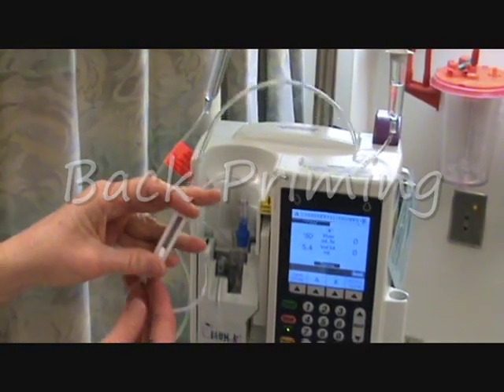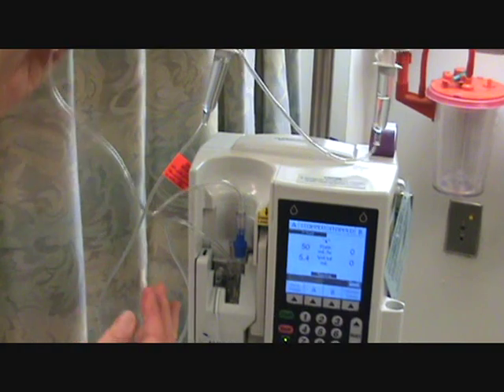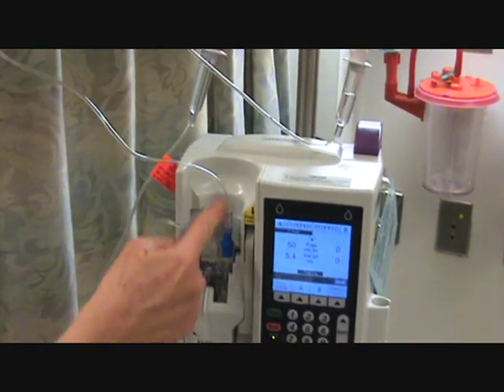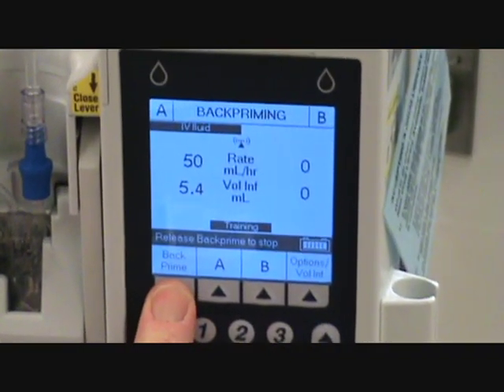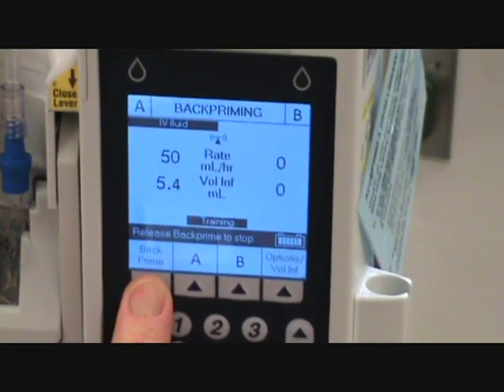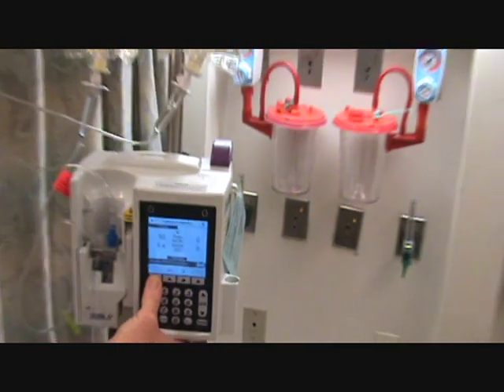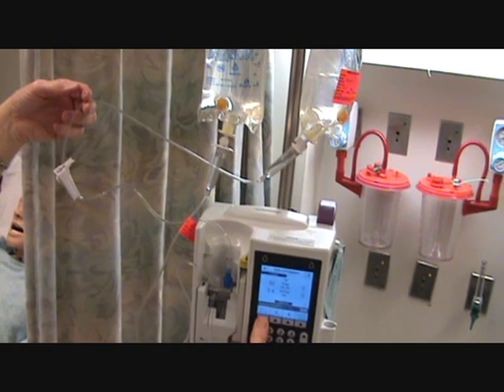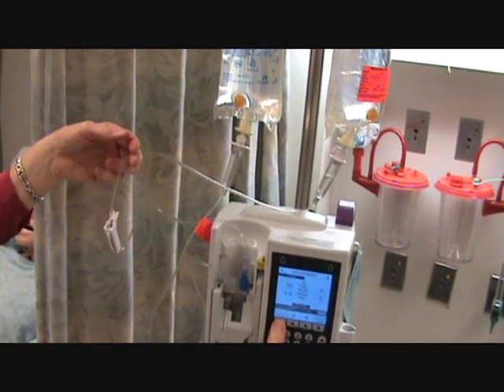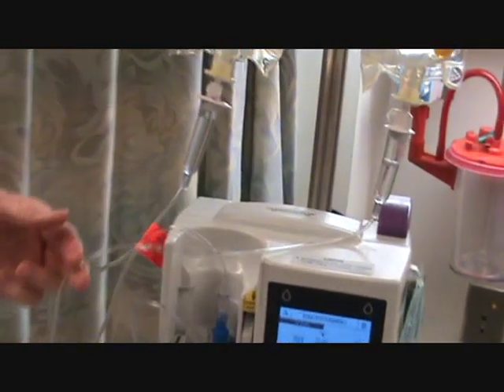We're ready to back prime now. We have to open our piggyback because we're going to be forcing air up through the tubing into the secondary bag. As you can see, the air is being forced up the tubing — this is called back priming.